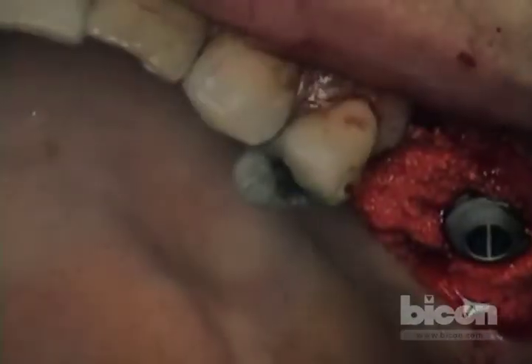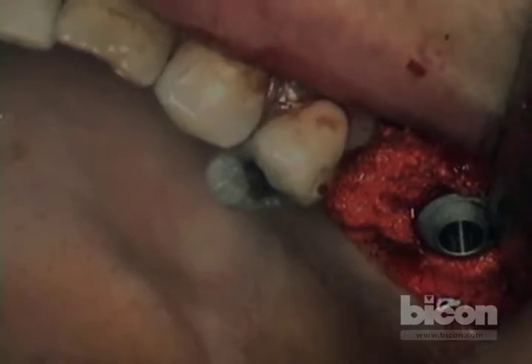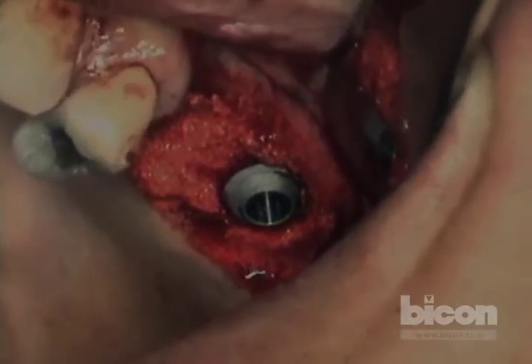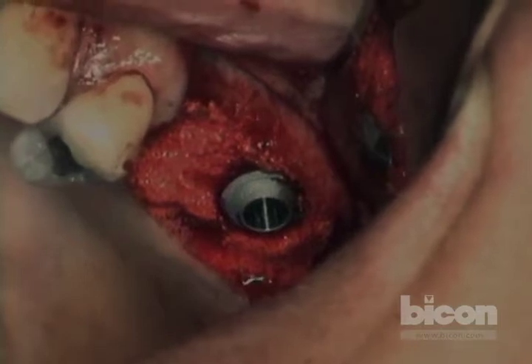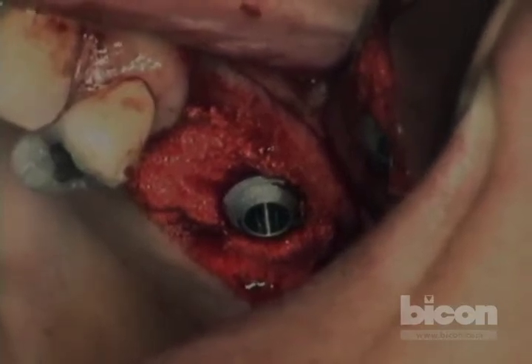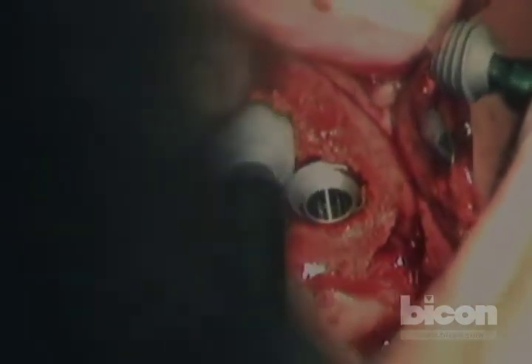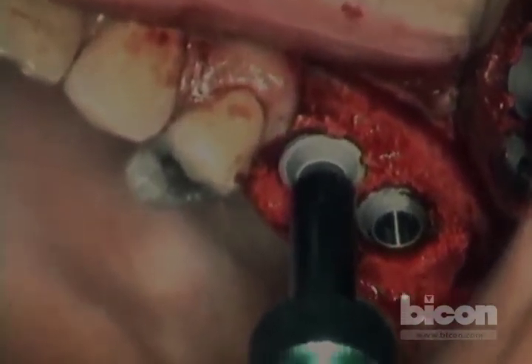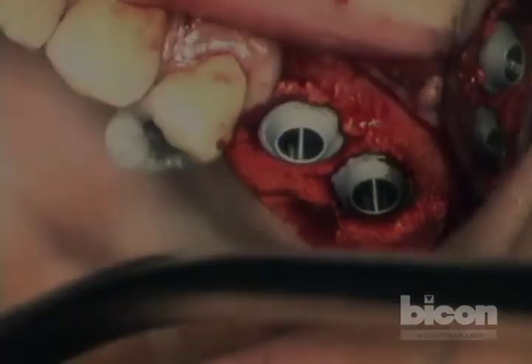We'll just leave the implant in there. Then let me put the other implant in — the mesial one. We'll put two abutments, tap them in place, and finish up. This is the first time we do this case under sedation because we wanted to engage the patient while getting everything worked out with you. Most often, these cases are done in about 20 minutes to half an hour, and there is no need for sedation. I'm feeling resistance — that's always a good thing.